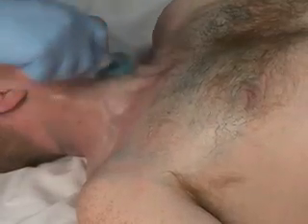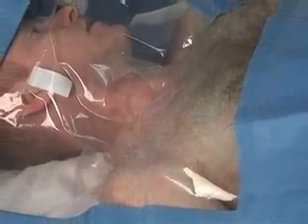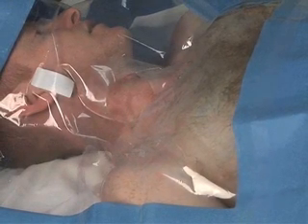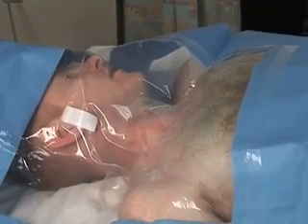Prepare the area by scrubbing the skin with chlorhexidine for 60 seconds and drape the site. Be sure to include all landmarks within the sterile field. If the patient is conscious, explain that his or her face will be covered, but that breathing will not be obstructed, and that he or she can signal for attention by raising his or her hand.